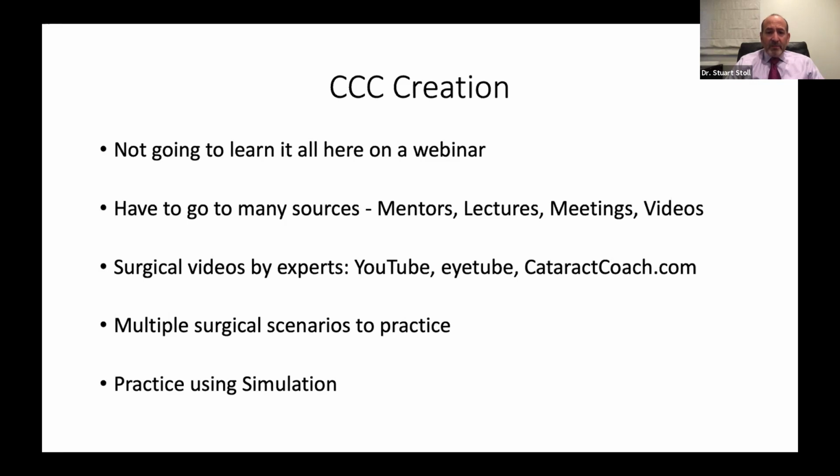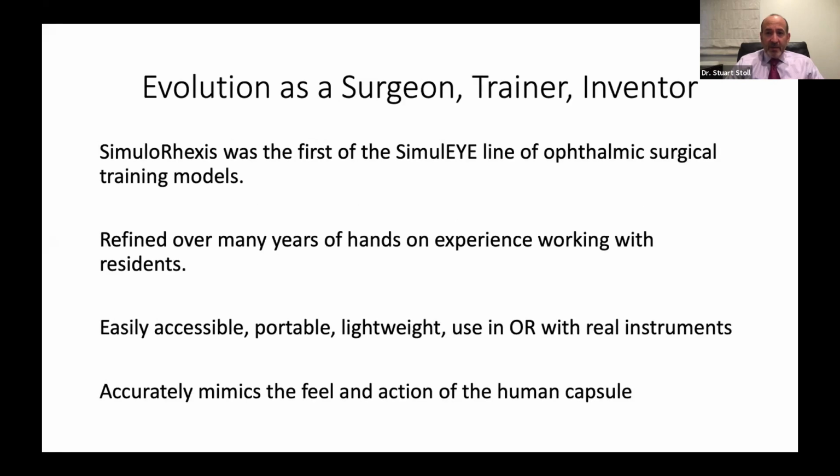There are multiple surgical scenarios to practice, and we should practice using simulation. There's no reason not to practice ahead of your cases.